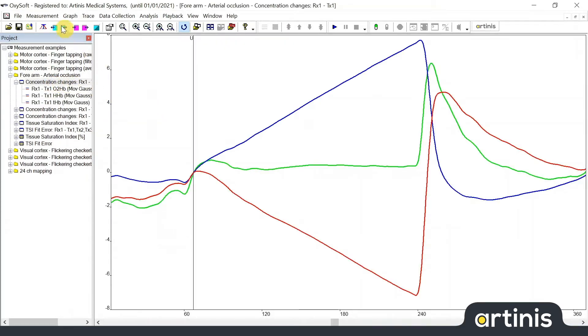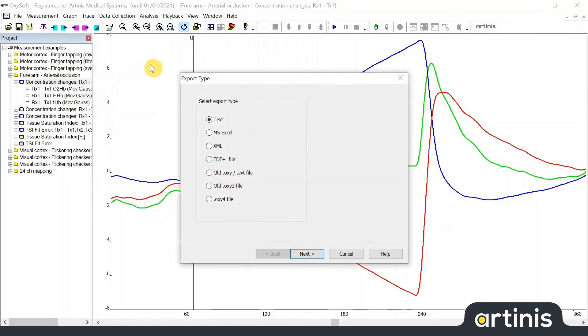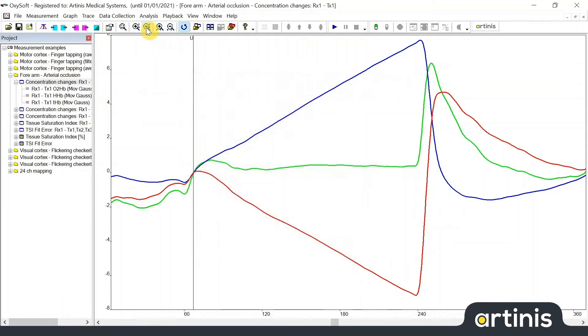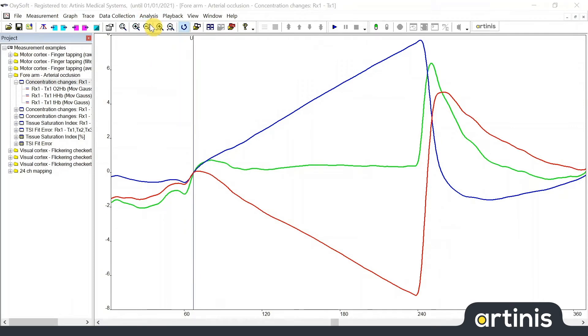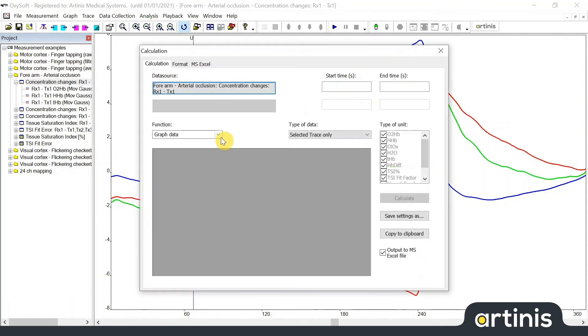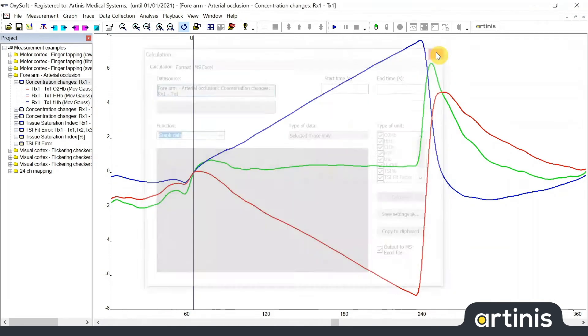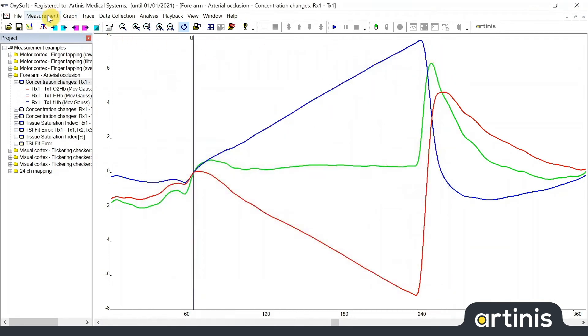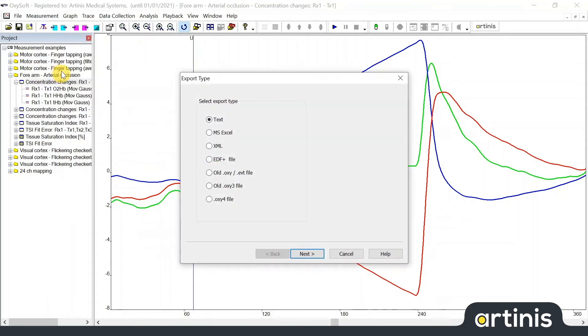There's two ways to export your data. Select measurement export measurement or you can select analysis calculate and use the function graph data. In this video I will show you how to export your data making use of the function export measurement.